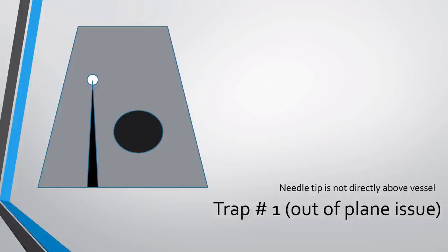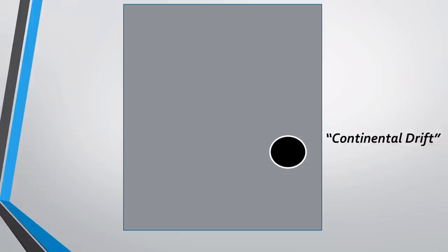In this particular problem we can see that the vessel isn't perfectly aligned with the middle of the screen and the needle is not directly above the vessel. The first issue I like to call continental drift. It's usually more obvious to someone watching over the shoulder than to the actual person performing the procedure. It tends to happen at the beginning when the person doing the cannulation takes their eyes off the screen — perhaps to get hold of a cannula or to prep the skin — and the probe just tends to follow its natural tendency and slide down lubricated slopes.